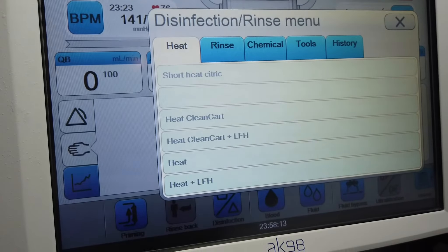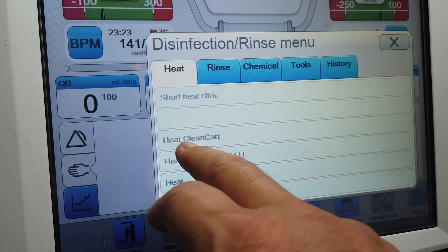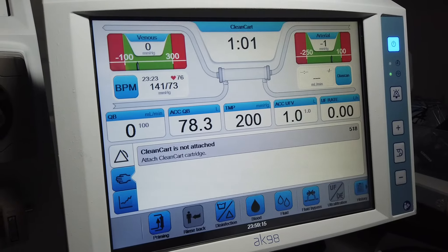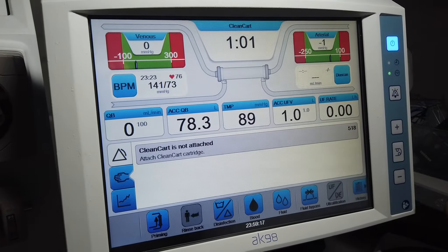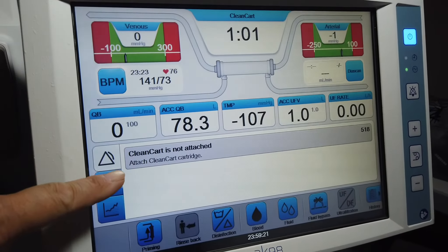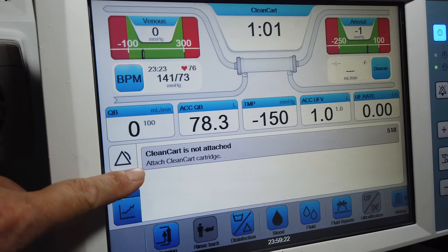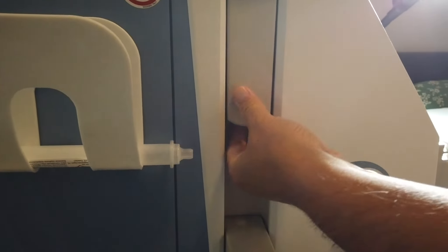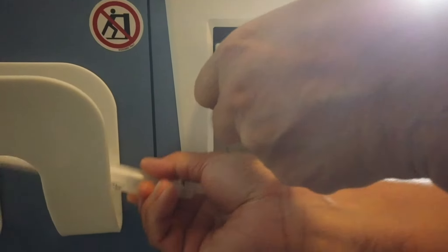Once confirmed, we can go ahead and close the menu. If it's a C machine, we press heat clean cart. After a minute or so, the top screen shows clean cart and it says: clean cart cartridge is not attached — attach clean cart cartridge.